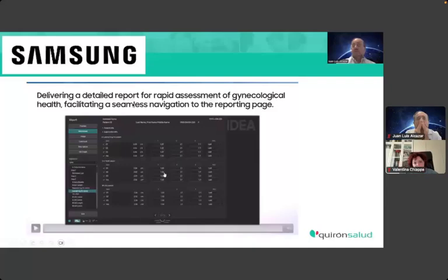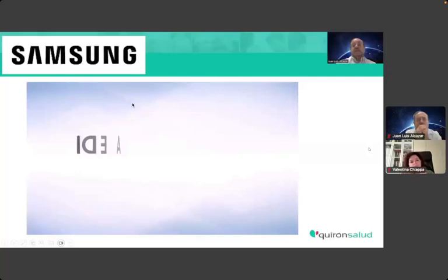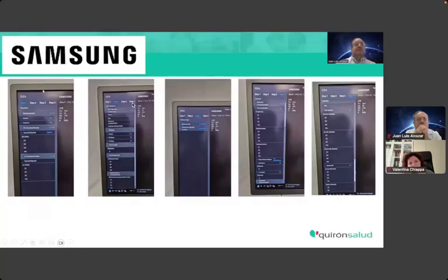You can measure them. Also, you can measure the ovaries, of course, and then you can follow to the 2nd step, to the 3rd step, and to the 4th step, as you will see. And this is how you see in the screen all the 4 steps.